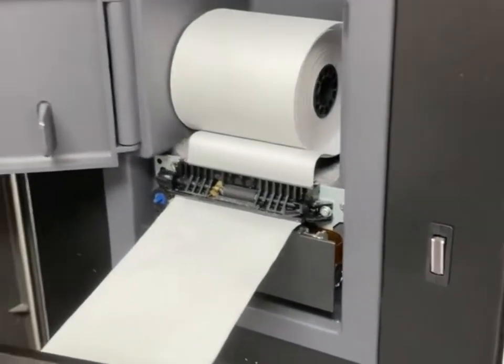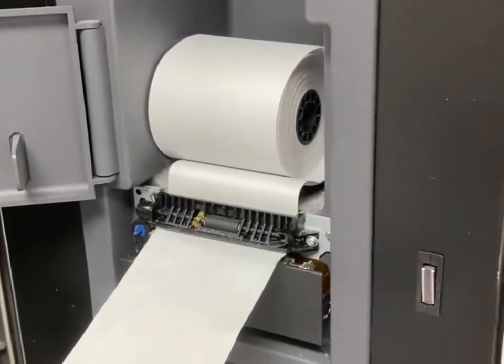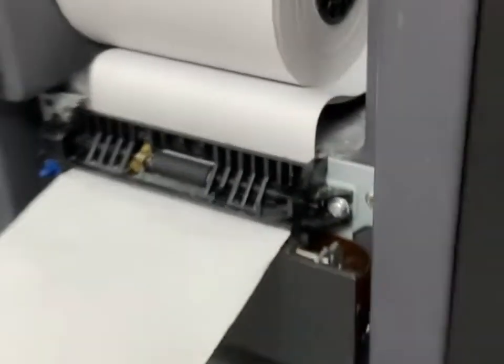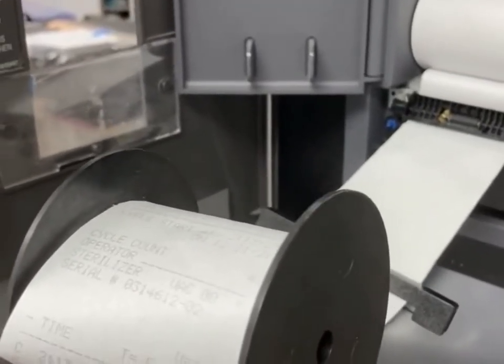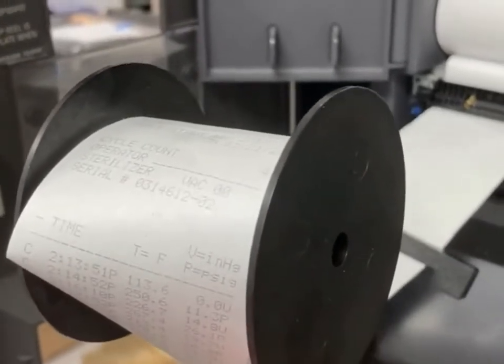You basically just tear the printer paper and put a new roll in, then feed it down into the motor, which then feeds it up to the spool that houses all recorded and printed cycle data.